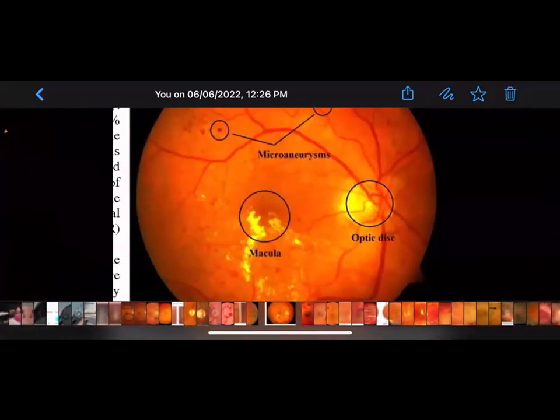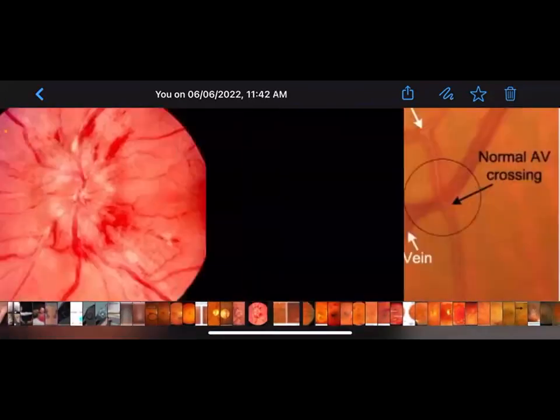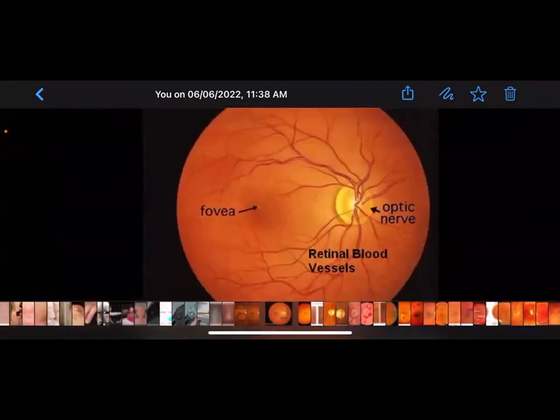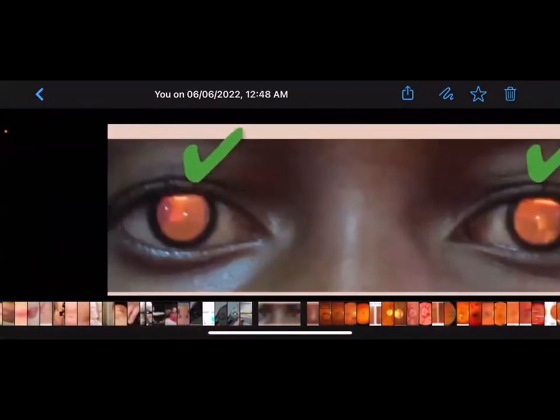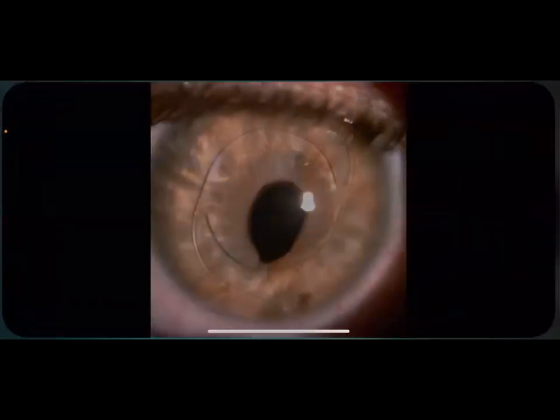The diagnosis was written at the top of the feedback: the patient has proliferative diabetic retinopathy, did laser therapy. There is cataract on the left side, and there is an implanted lens in the anterior chamber of the right eye. This is the shape of the lens here. It's really difficult to see the lens in the exam setting. But anyway, this is the shape of the lens. Maybe if you elevate the eyelid, you will be able to see the lens more clearly.